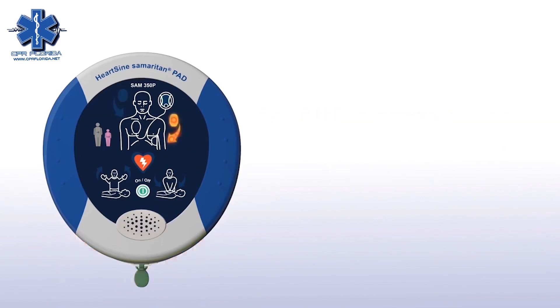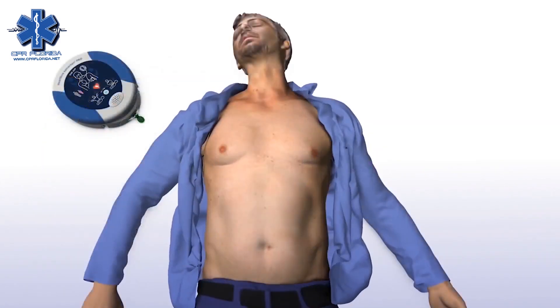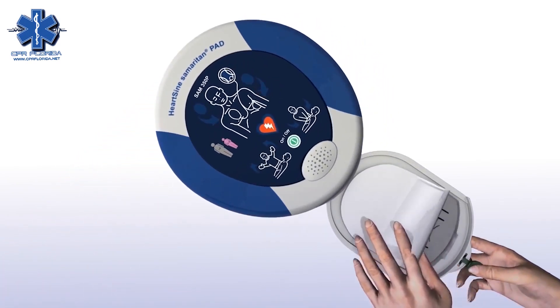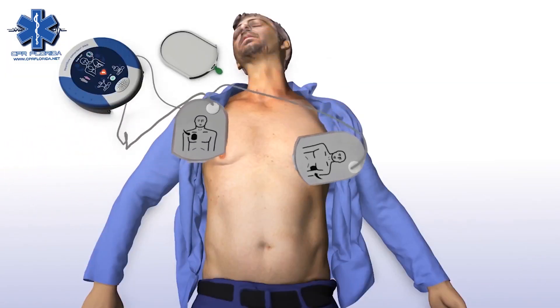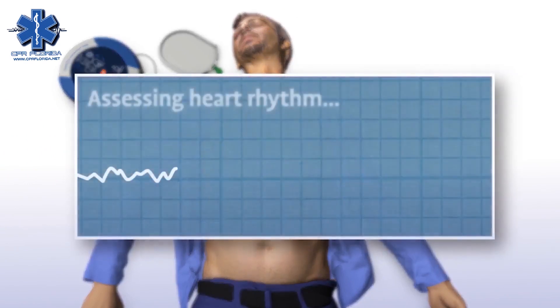Adult patient — call for medical assistance. Remove clothing from the patient's chest to expose bare skin. Pull the green tab to remove pads, then peel pads from liner. Apply pads to the patient's bare chest as shown in the picture, and press pads firmly to the patient's bare skin. The Samaritan PAD automatically assesses the patient's heart rhythm.